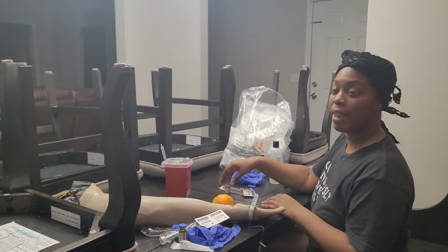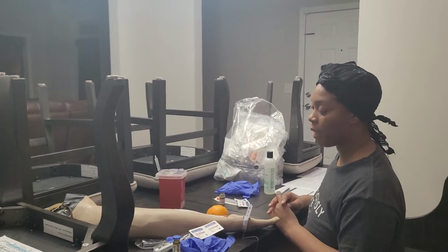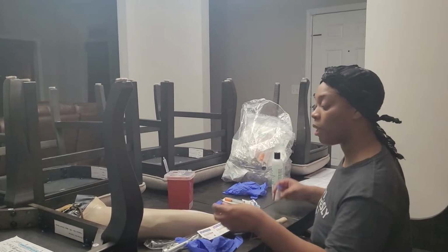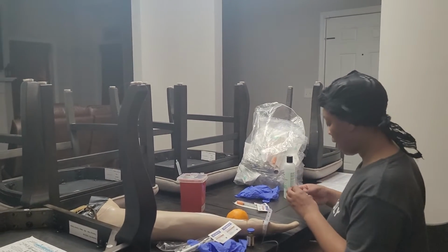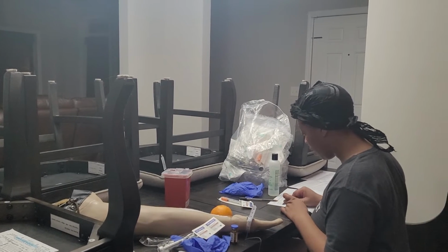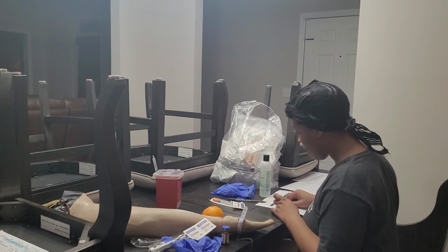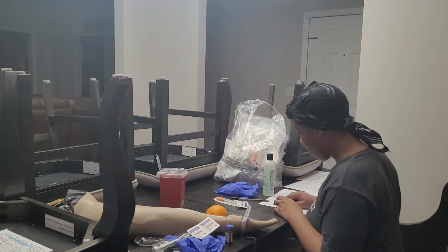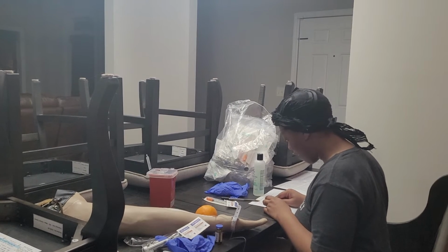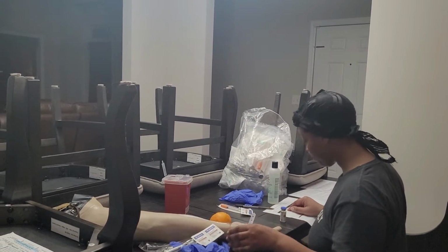Hi, my name is Leah, and I'm about to administer a subcutaneous injection and an IV push medication. Right now, I'm at my medication cart, pulling my medications out of the cart, and I am going to check that the medication is for Millie Larson. Her date of birth is 1/1/1936. She is scheduled to have furosemide 20 milligrams, IV push every 12 hours.